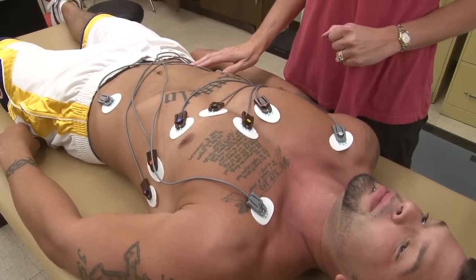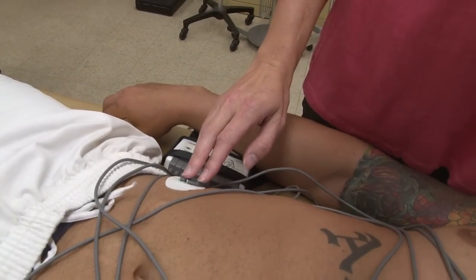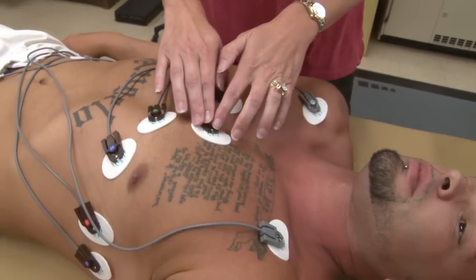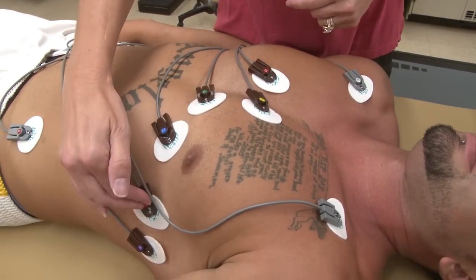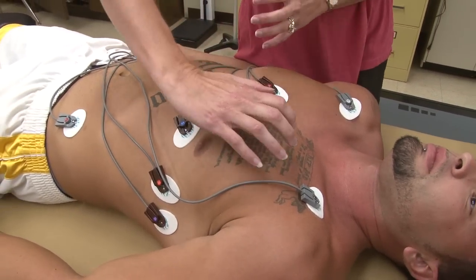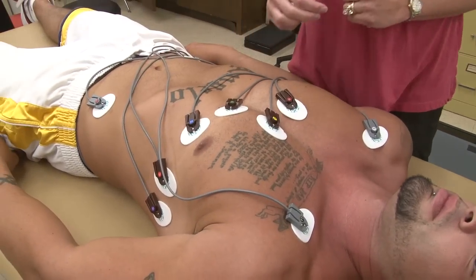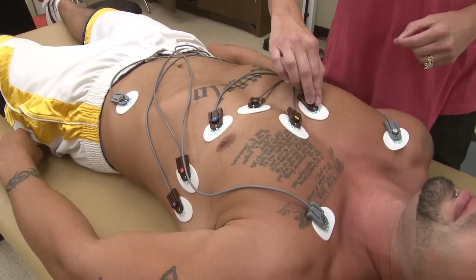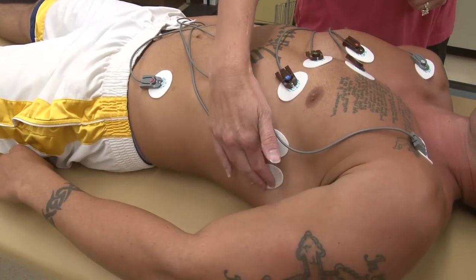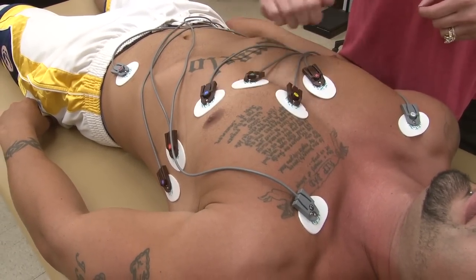Now the right leg actually serves as the ground, and because of that, we don't really consider it as one of our main leads. We also have precordial leads, and there are 6 precordial, also known as chest leads. These precordial leads take different views of the heart. The heart is centered around here, and it's angled this way in most individuals. V1, V2, V3, V4, V5, and V6 are all of our precordial leads that take different pictures of the heart.